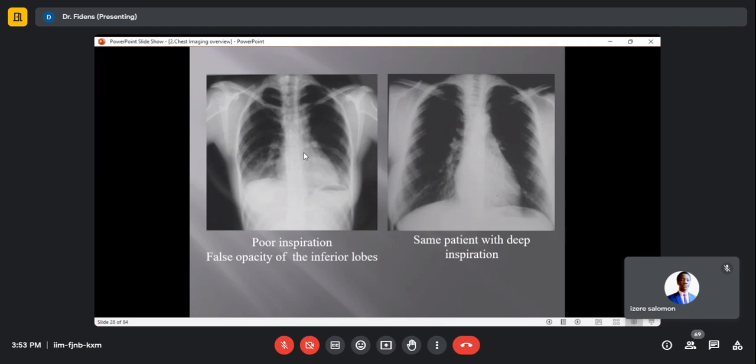But on the X-ray machine we have a button for kVp to increase and reduce, and a button for mAs to increase and reduce. When you increase the mAs without touching the kVp, you are sending too many X-rays, but without increasing the power, the intensity of those X-rays. But when you increase the kVp, you also increase the power, the intensity of the X-rays you have produced. Okay?